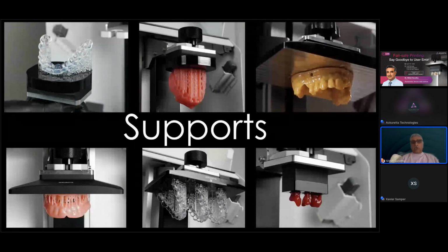Look at the denture in the top center, for example. That is a denture that is printing not the intaglio surface, but the oral surface of that denture. And in this instance, you've got multiple supports because there's a very deep palate on that denture, and you need supports to go into every part of that print in order to ensure that no part of that print is unsupported.